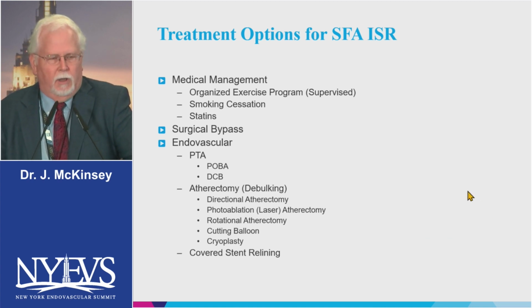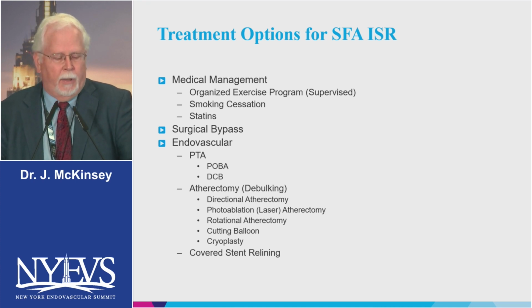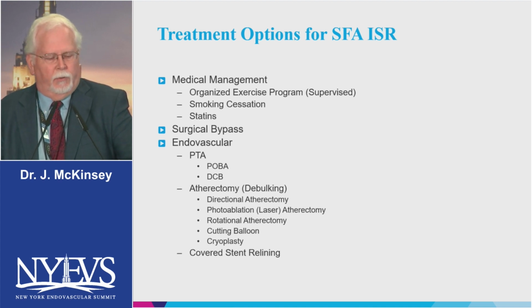Surgical bypass, again, I will try and do endo first in most cases, but after several failures, I will go back and try and discuss at least doing a surgical bypass. Now, bad CLI with large wounds, Rutherford-Becker 6, those are ones I generally go to surgical bypass first.